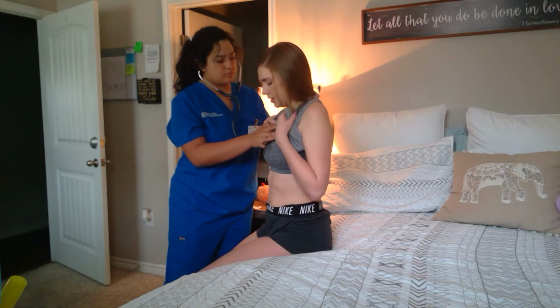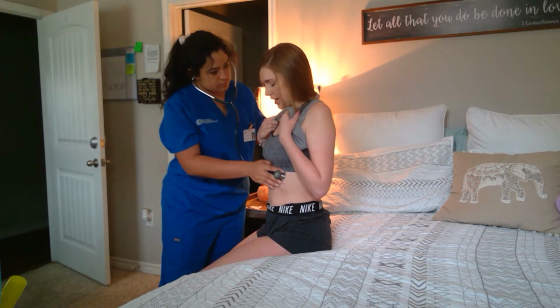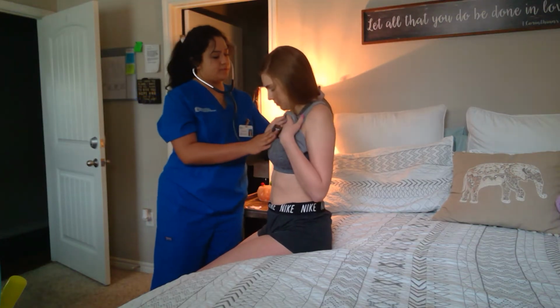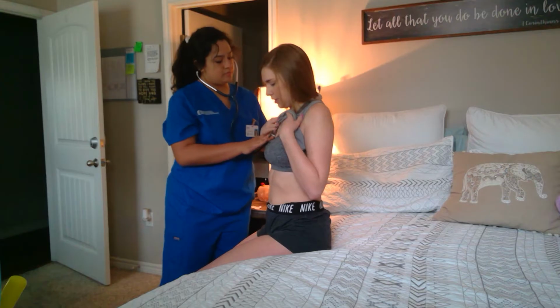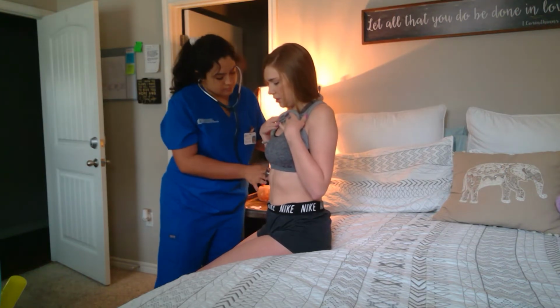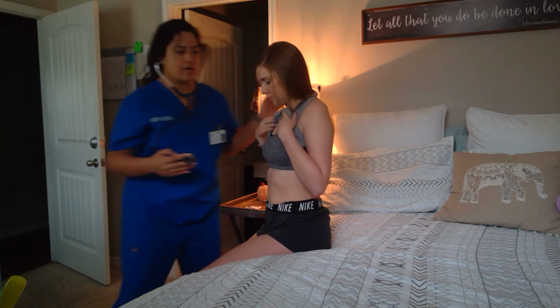99, 99. Okay, now I'm going to have you say E. E, E, E. Okay, now on the back.